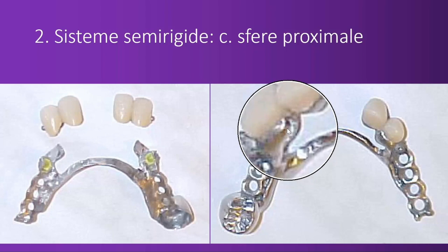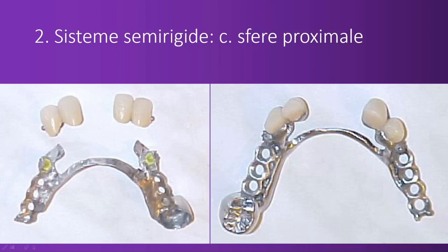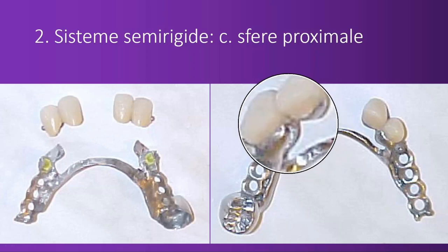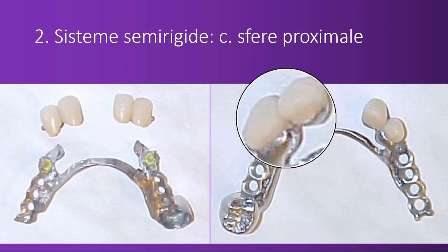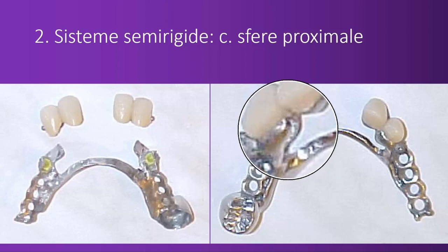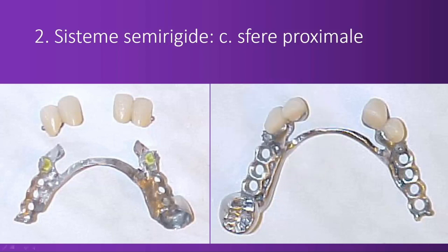Professor Andrei Ionescu allowed me to use this term, shoulder. He was very happy to use this arm and shoulder. Actually, as a friend sets his arm on the shoulder of his friend, right? You see, the palatal part, the fixed part, is a shoulder, and from the denture comes an arm, and it's quite intuitive. The arm sits on the shoulder, as two friends would go.